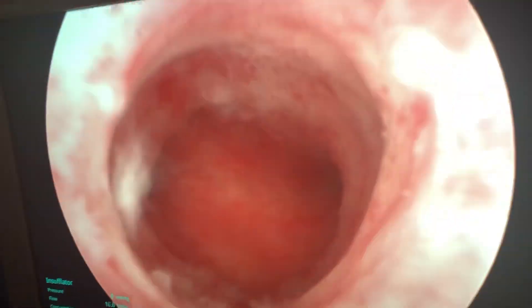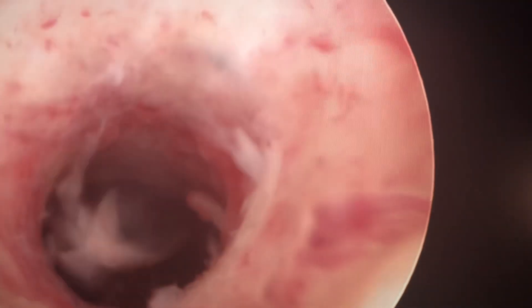Right now we have a telescope in her uterus and salt water is opening up her uterus, giving us room to work. So if we look at the TV screen now, you can see here's what it looks like up inside what's called the cervical canal.